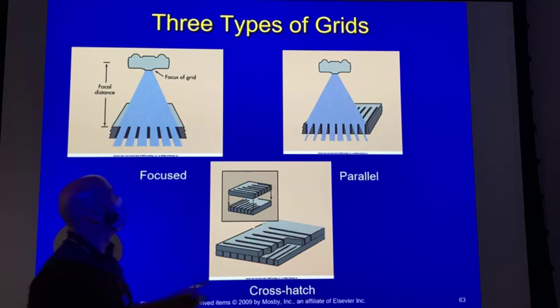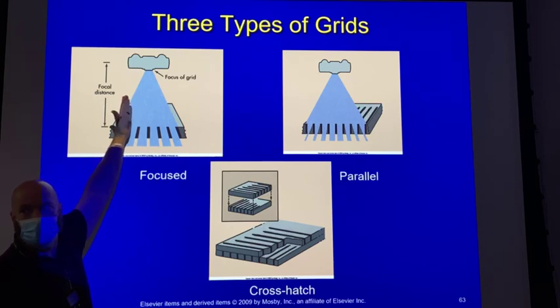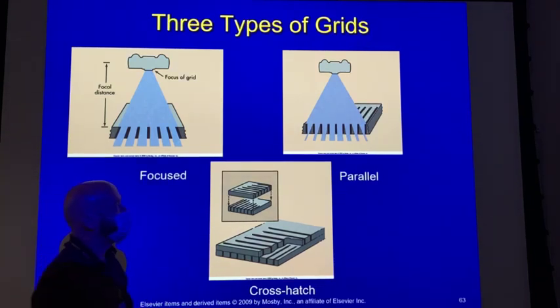Okay? But what if our X-ray tube is off-centered on a focused grid? Yes. You're going to have a problem, right? It's got to be parallel to the middle, the midline, not necessarily the midpoint, but the midline of the grid.